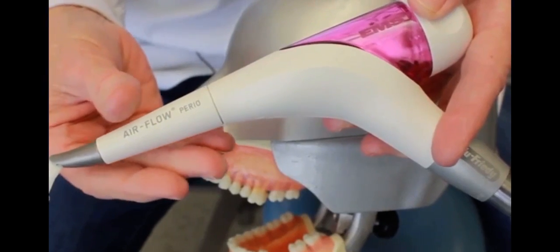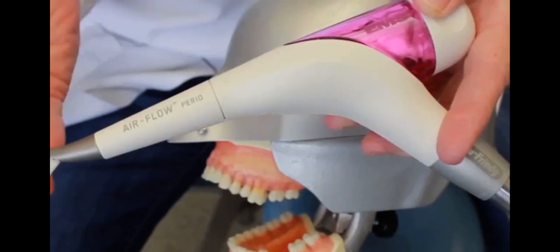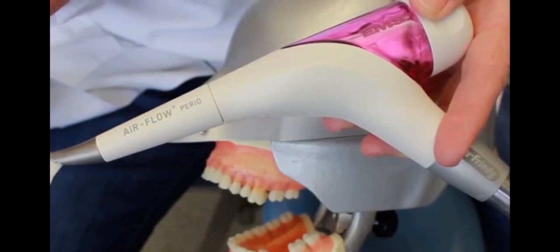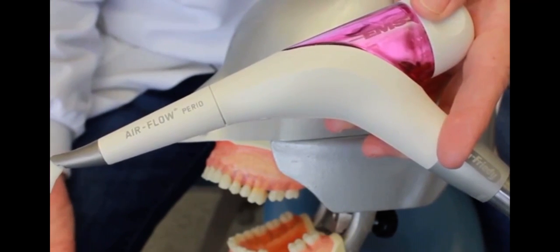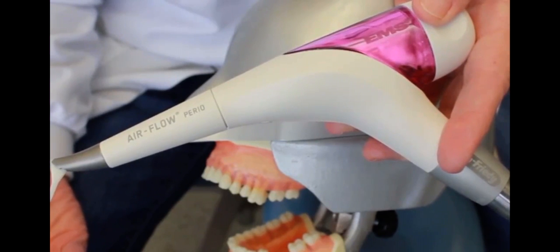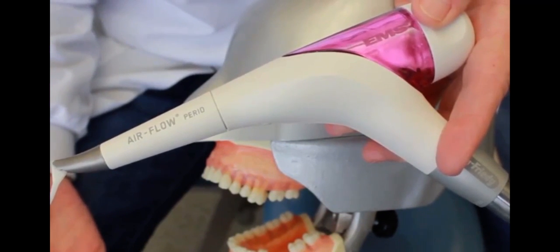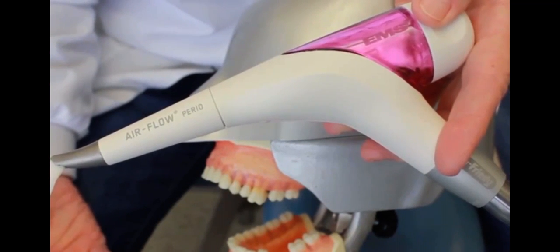In the past few years, indications for the use of air polishing technology have moved from supragingival to subgingival use. The supragingival air polishing uses sodium bicarbonate, which is a really large particle and very abrasive. You can only use that on the coronal surfaces of the teeth to remove biofilm and especially remove heavy stain.